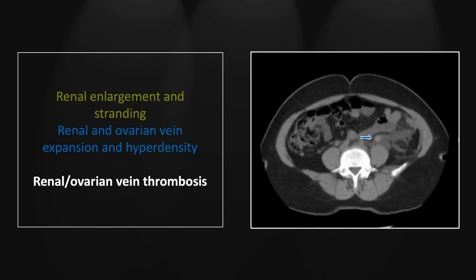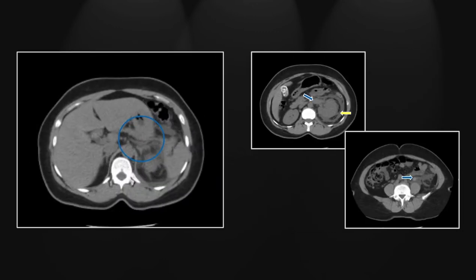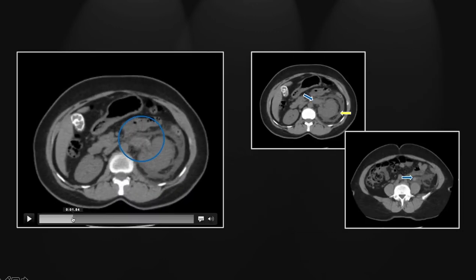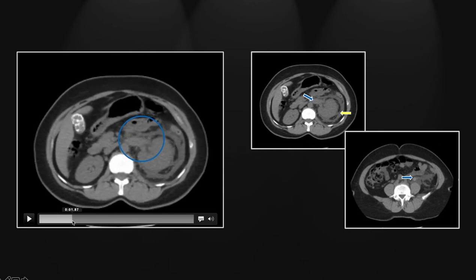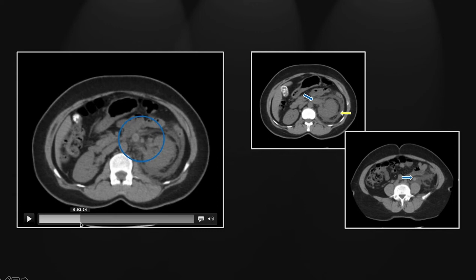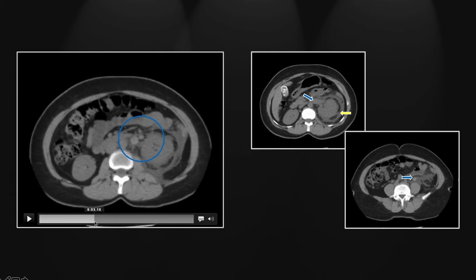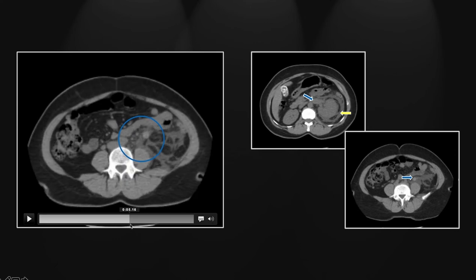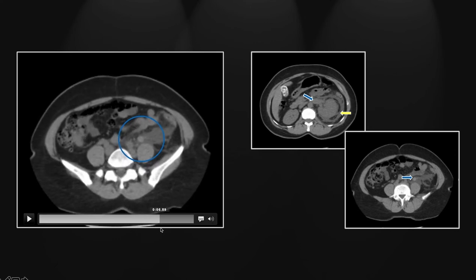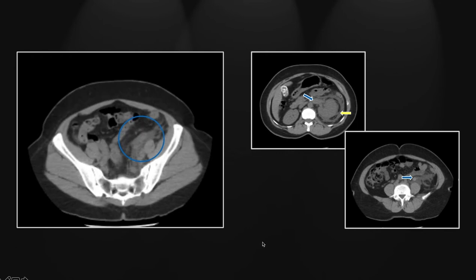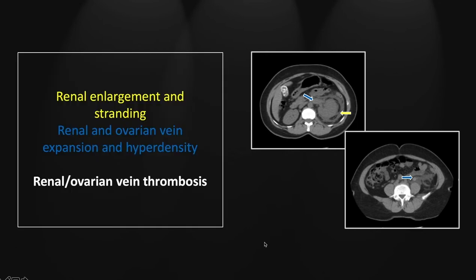More inferiorly, you can also see expansion and increased density within the left ovarian vein. Fairly commonly, left renal venous thrombosis will extend down the ovarian vein. Here you can appreciate that hyperdense and expanded left renal vein, and as we go inferiorly, it extends into that left ovarian vein, which is markedly enlarged, tortuous, and hyperdense. So that is a case of left renal and ovarian venous thrombosis.